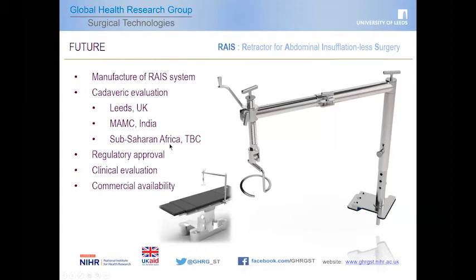And the idea here is that we're looking for an idea of surgical acceptance, so how well does it perform surgically, and also how well does it suit different environments. So it's all very well us trying it in Leeds. Are there different challenges faced in an environment in Africa or in rural India? We'd like to understand how well the device works in those different contexts.